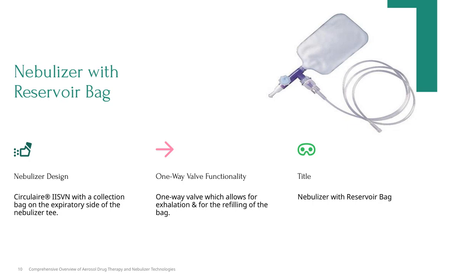Now, let's take a closer look at the one-way valve functionality. This valve is crucial because it allows the patient to exhale comfortably, while also enabling the bag to refill with fresh air or medication. Essentially, it ensures a smooth, unidirectional flow, which is vital for effective aerosol therapy.